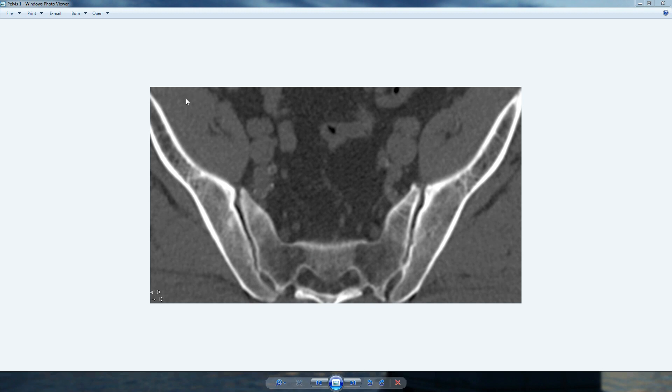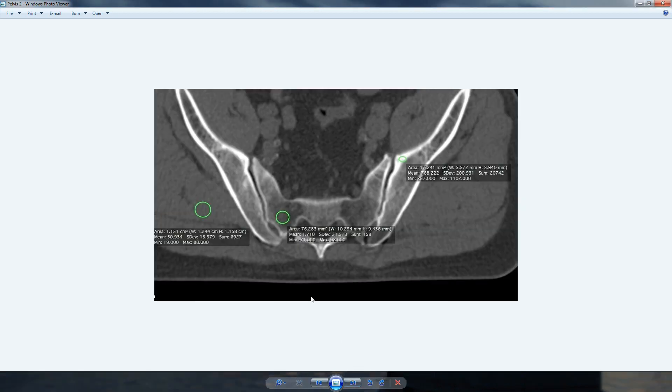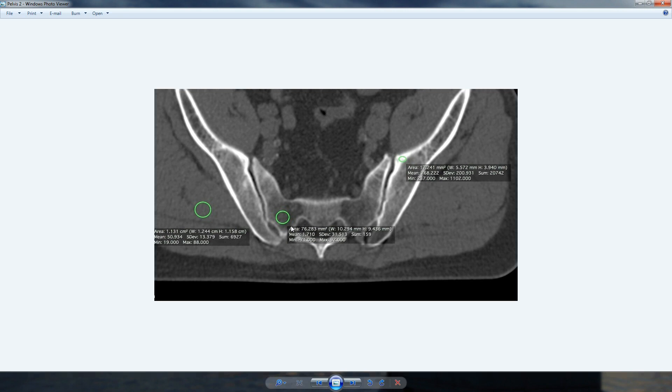Outside the bone, we can see muscle, which is indicated by this grayish color over here and over here. And intra-abdominal fat is represented by this dark gray color. If we measure the density of the bones in Hounsfield units, which is the unit of density that is measured on a CT scan, we can see that very dense cortical bone here measures 768 Hounsfield units. The less dense medullary bone over here, which contains bone marrow and a lot of fat, measures 1.7 Hounsfield units. We can see over here the muscle of the gluteus maximus, which is in the buttocks area, measures about 51 Hounsfield units. So in this case, the medullary bone is actually less dense than the muscle around it.